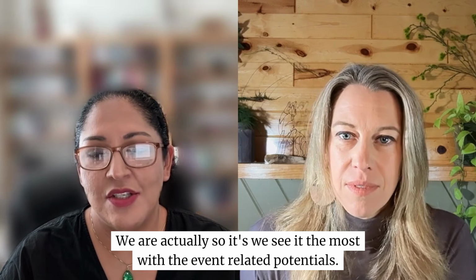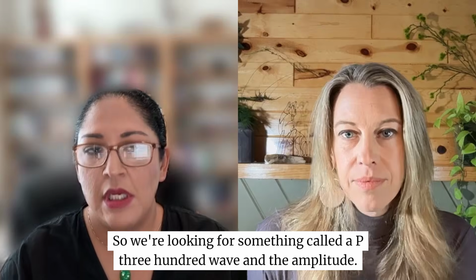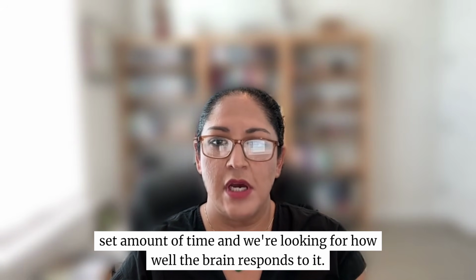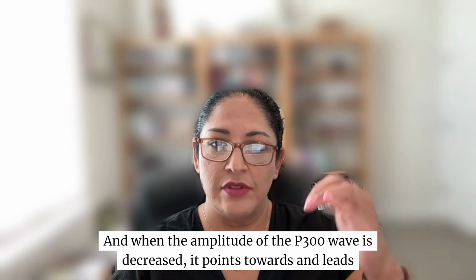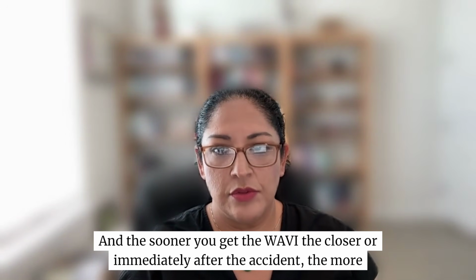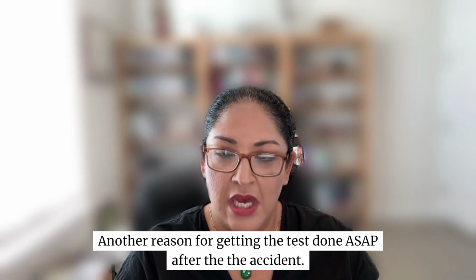We are, actually. So we see it the most with the event related potentials. We're looking for something called a P300 wave and the amplitude. Essentially, as I explain it to the patients, we give them a sound stimulus during a set amount of time, and we're looking for how well the brain responds to it. And when the amplitude of the P300 wave is decreased, it points towards cognitive impairment. And the sooner you get the WAVI, the closer to immediately after the accident, the more sensitive the test is. Another reason for getting the test done as soon as possible after the accident.